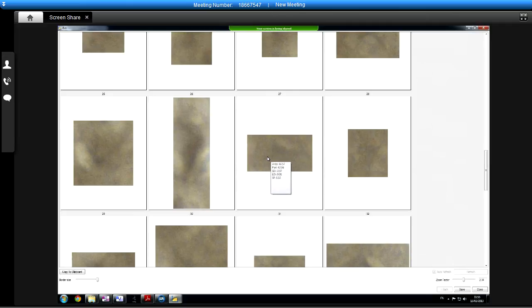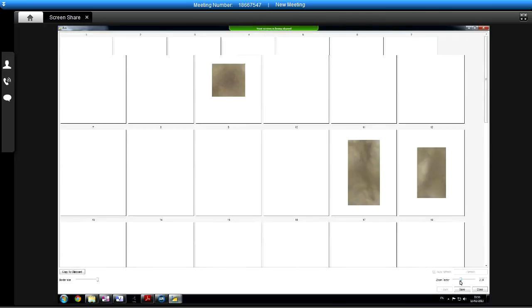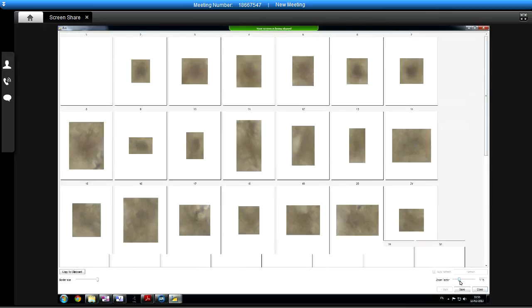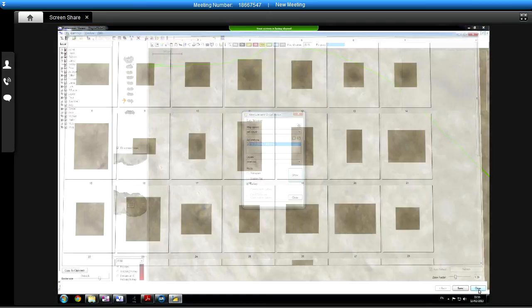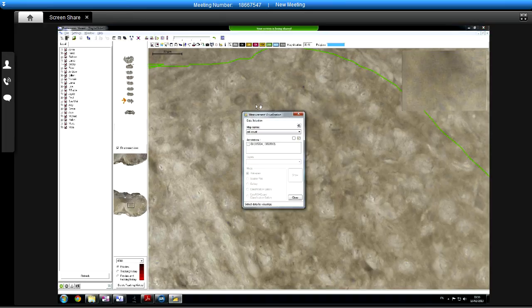Sorry, how did you get into that window? Okay, so let me do it again. Click on the little graph, which is measurement visualization, and then just select the annotation that I want to look at before. You can select multiple here. There are multiple annotations, and then just gallery, and then show, and then I just maximise it to make it a bit bigger.